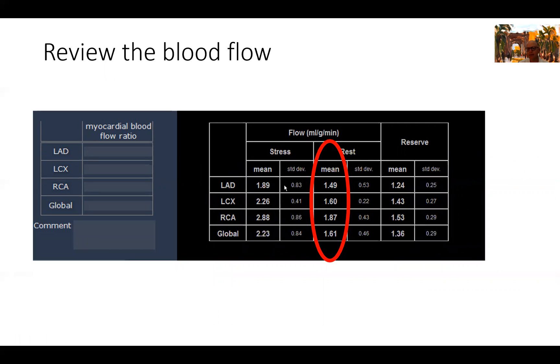Now we go to the review of the blood flow. You can see here the myocardial blood flow reserve is depressed mainly in the LAD, but also in the other segments and globally. The cutoff, as we talked about before, is about 1.8 for our lab. It's depressed for all. But just remember here that you have to QA this. There's a QA process. One part of the QA process is to check the resting flow.